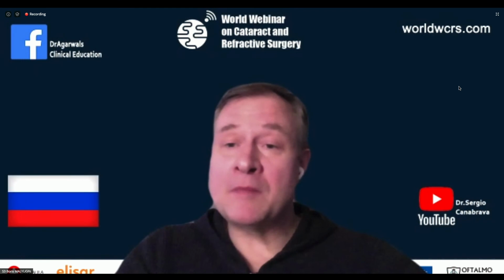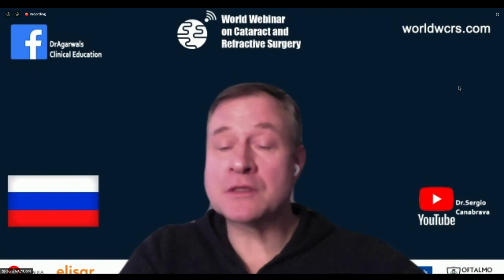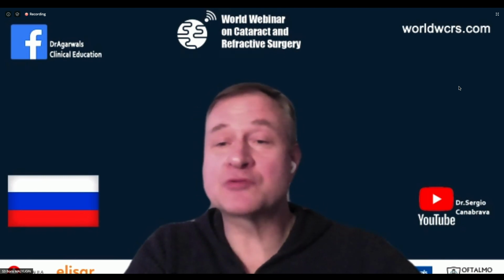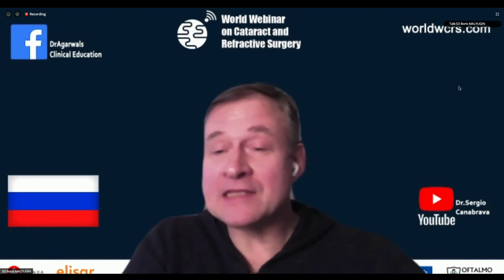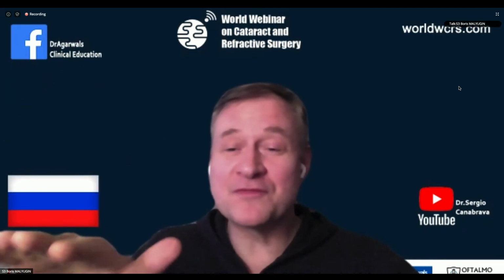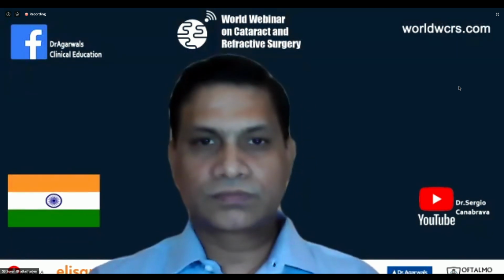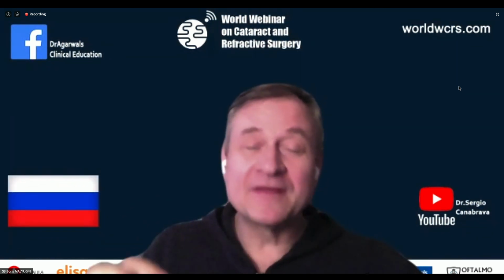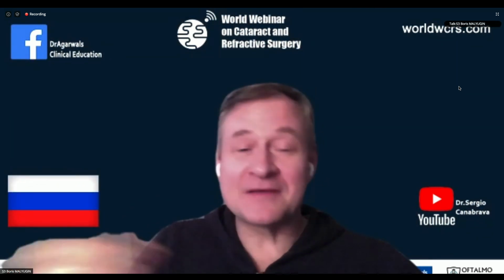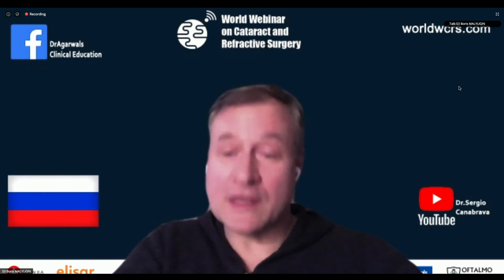Yeah, and maybe I will add a few words: if you're a bit concerned that you will catch the capsulorhexis, I think a good idea, at least for the Malyugin, is to inject the ring and place it on top of the iris. Do not try to engage it at the same time, and then do it one by one with an instrument. I think it's quite safe and easy to do that.